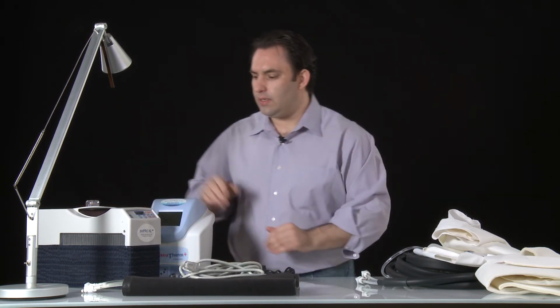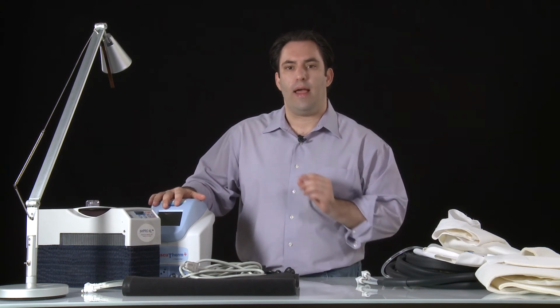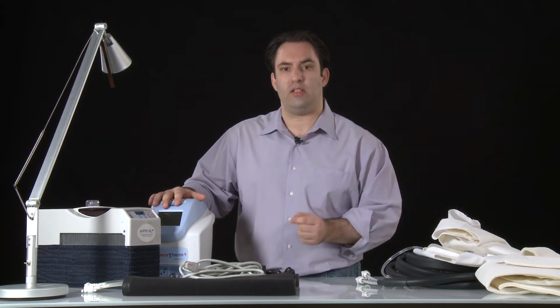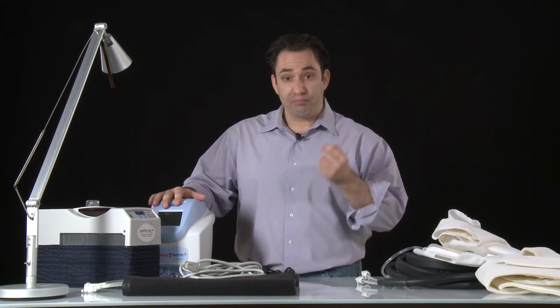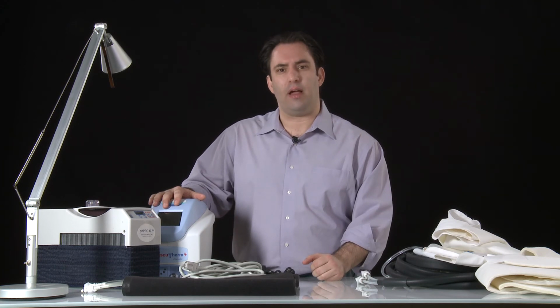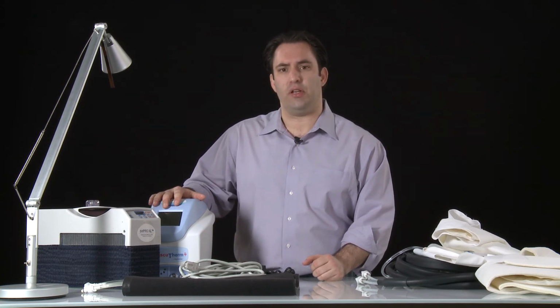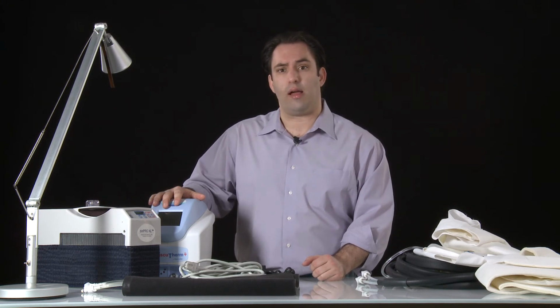So who would use these? Anybody going through just about any type of orthopedic procedure has found this to be helpful. Certain applications in bariatric and GYN surgery as well, but predominantly it's going to be knees, hips, shoulders, ankles. And did I get everybody? I think I did. Yeah, and elbow fractures in young people, pediatric elbows. Sometimes wrist fractures as well for patients that have very low tolerance of opioids.